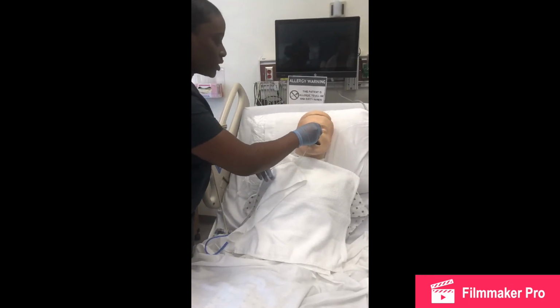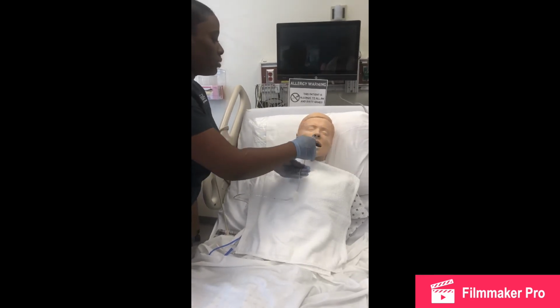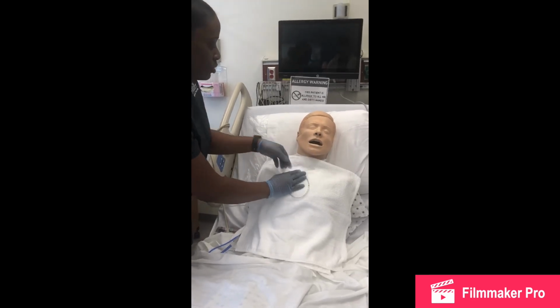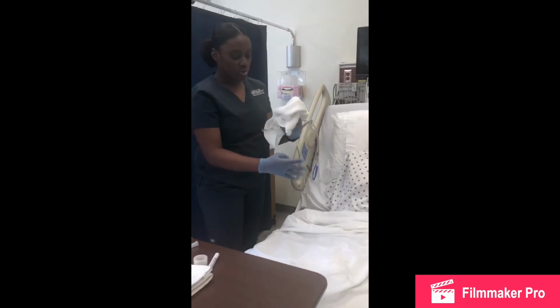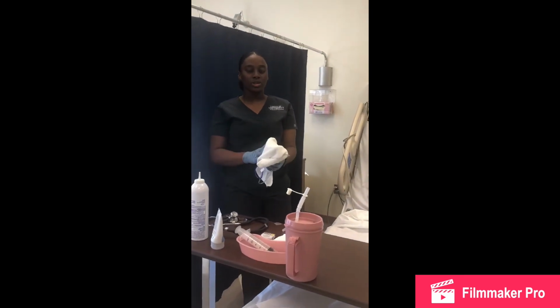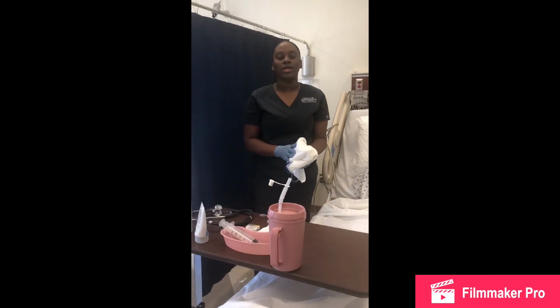Then I will tell the patient that I'm going to take the tube out, and then carefully, 1, 2, 3, carefully walk it through, wrap it in the towel. Then I will go to the bin and throw the tube inside of the bin and put the towel into the laundry basket. So that is my video on how to remove an NG tube.